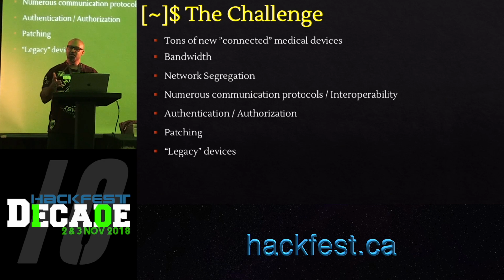And then I suggested that perhaps we could, because in North America, in large hospitals, there are already around 12, 13 medical devices per bed. So I'm like, why can't we just do segregation per bed or per room? So that will, in that case, if the device is compromised, there's only going to be one poor bastard, but the rest of the other people would be safe.